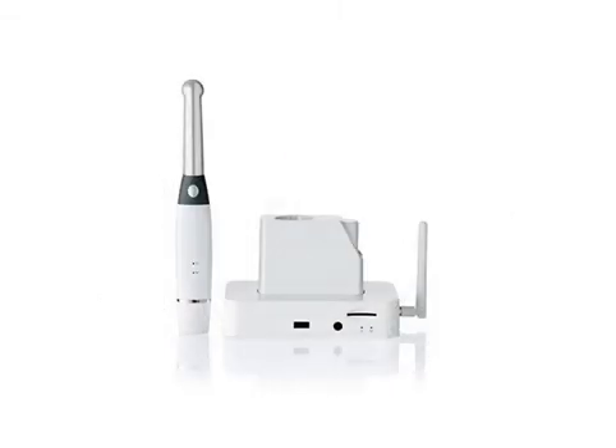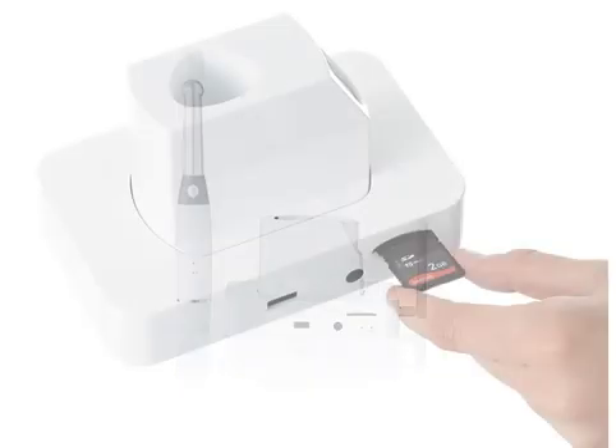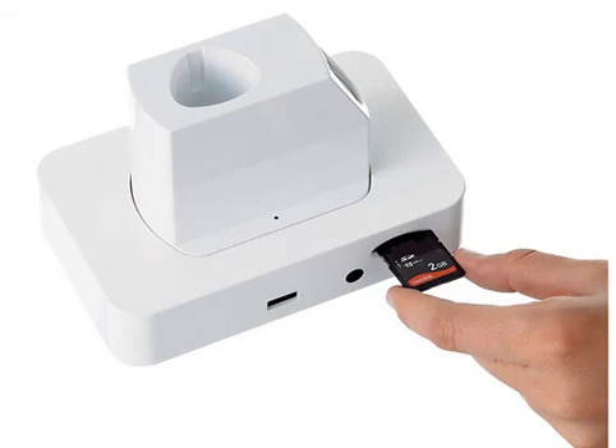The wireless camera uses a dock station as a communication hub between the camera and a workstation or monitor. When used with a workstation, it transfers the images and video to the workstation where images are viewed and stored using the imaging software included with the system. When used with a standalone monitor, up to 10,000 images can be stored on a removable SD card, and the images can be transferred to a workstation with an SD card reader.